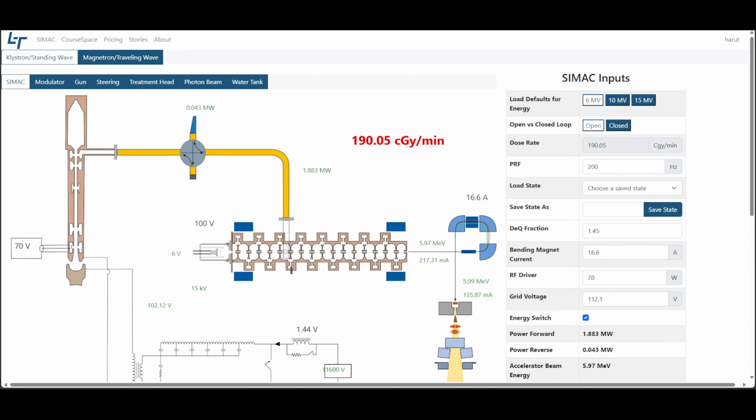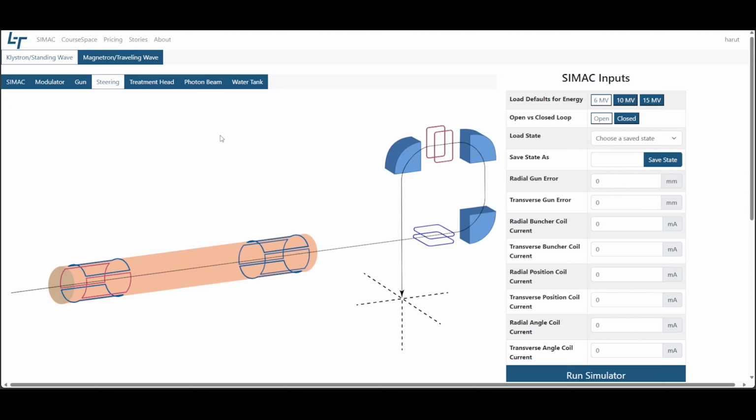We steer beams with magnets surrounding the entrance and exit of the waveguide. Let's see how to steer our beams and ensure they are symmetric. Let's go to the Steering tab and see how the magnets are controlled. Here you can see the 6 magnets that are used to steer the beam.